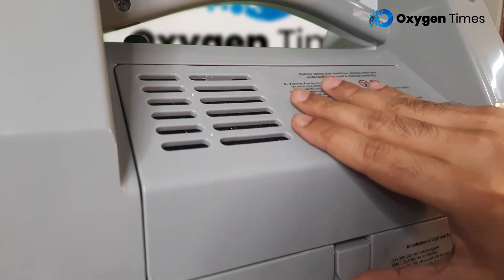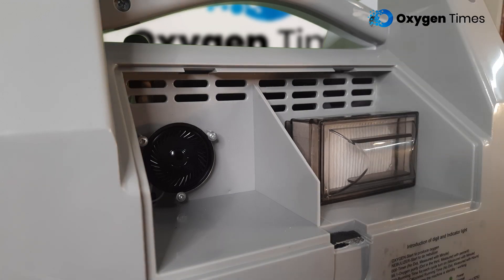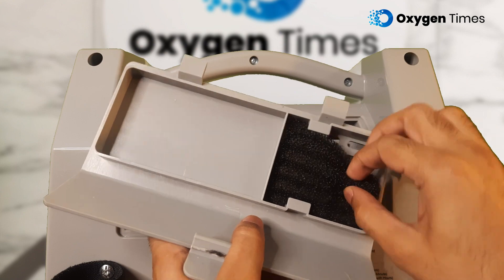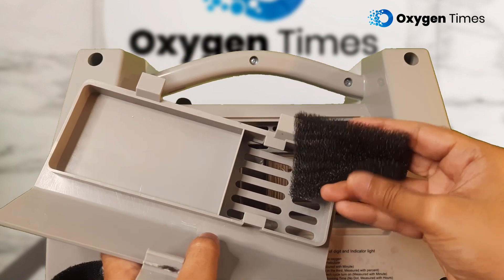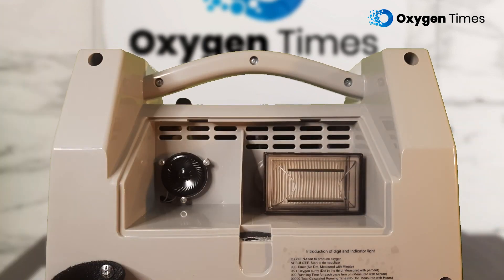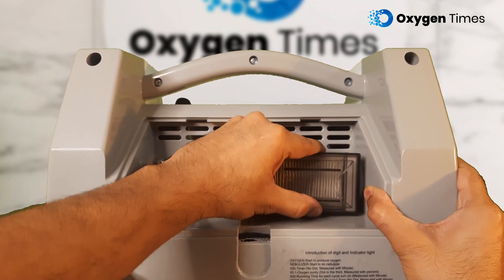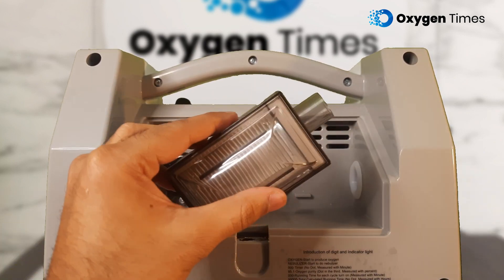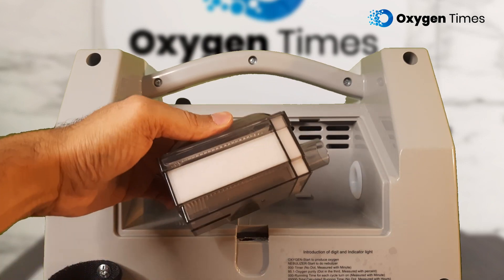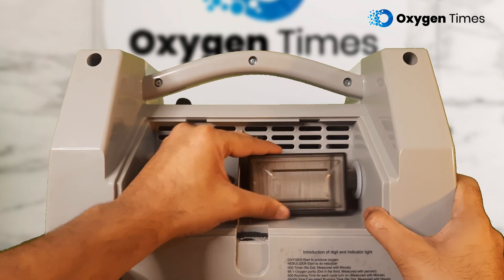Moving to the filters in the Evox 5 LPM, it comes with external and internal air filters. The external air filter is located at the back of the unit and can be removed easily and cleaned with soap and water once a week. Unlike many oxygen concentrators whose internal air intake filters are fitted in a way that only service providers can replace them, the Evox 5 LPM's internal air intake filter is user-replaceable. You can replace it at home without calling a service provider, saving both money and energy.